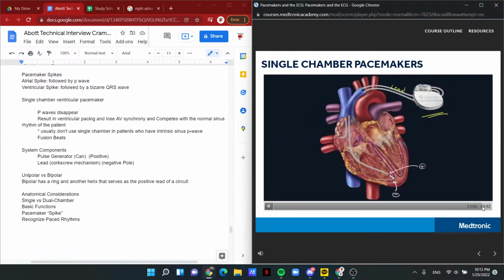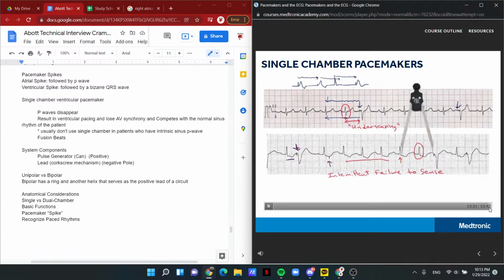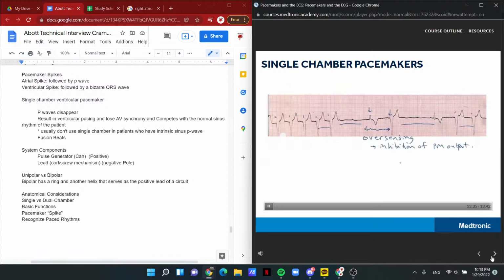We discussed single and dual chamber pacemaker systems. I showed you how leads are constructed, and we talked about the difference between unipolar and bipolar sensing, undersensing, and oversensing, which results in longer than expected intervals before a paced beat.